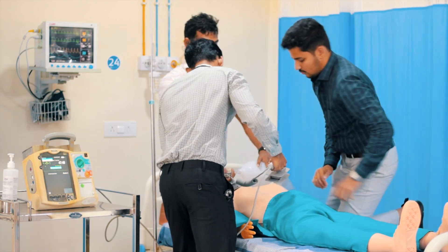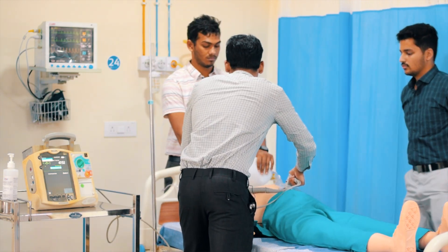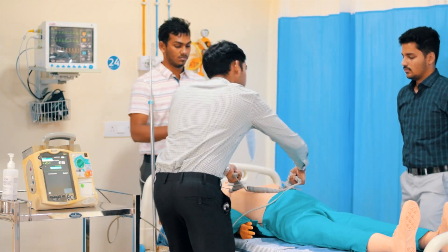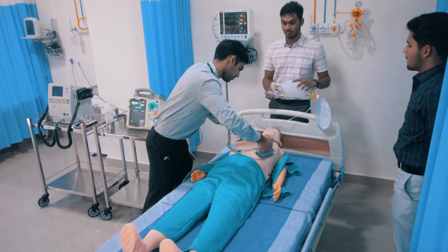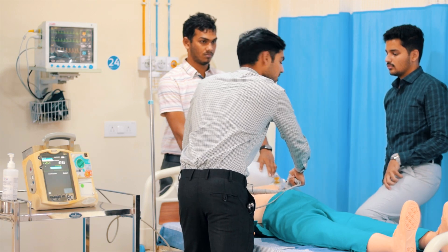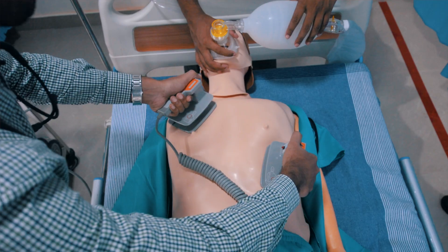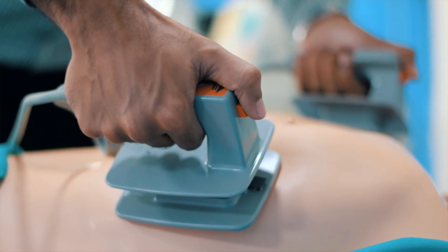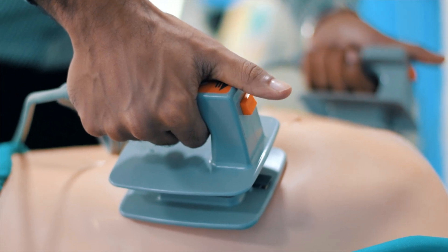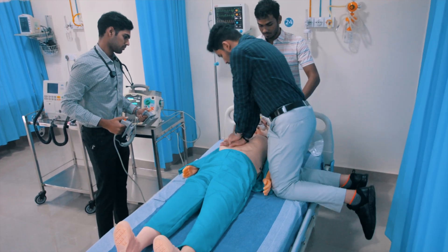To ensure safety during defibrillation, always announce the shock warning and shout firmly before delivering each shock. Check to make sure you are clear of contact with the patient, the stretcher, or other equipment, and make a visual check to ensure that no one is touching the patient or stretcher. Also be sure oxygen is removed from the patient. Deliver the shock by pressing both buttons on the paddles and say 'shock delivered.' Resume CPR right after delivering the shock.